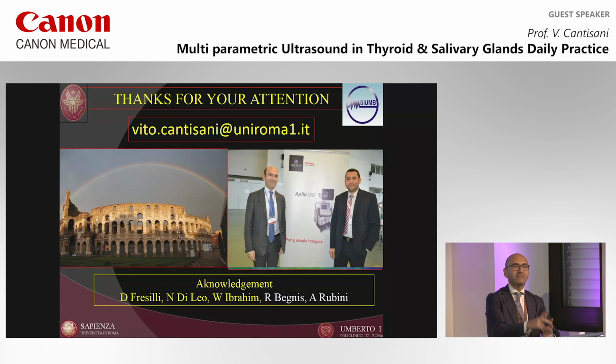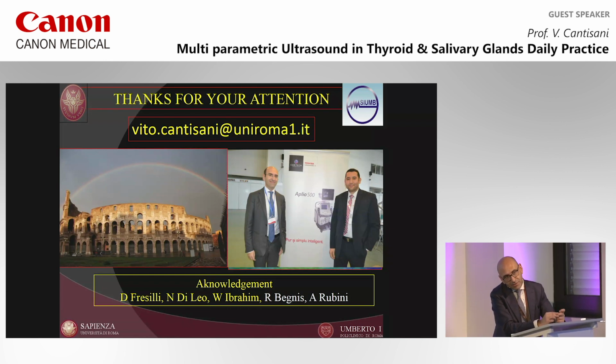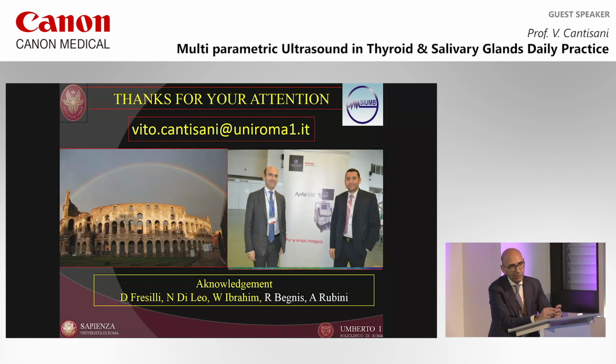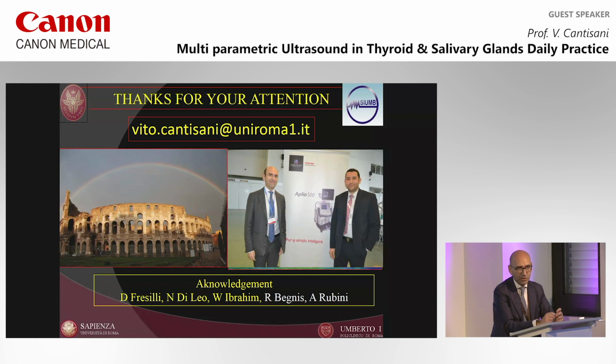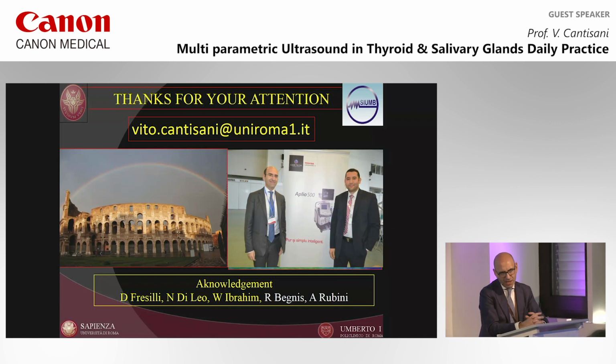Depends, of course. A question for you regarding the vascularity of these neoplasms. If it's highly vascular, how do you differentiate? Because thyroid anyway is a vascular organ. So can we confidently say that the vascularity is abnormal or not? Yeah, that's the reason why we are not including it in our evaluation. So we don't suggest to aspirate a nodule according to the vascularization. But we suggest to use vascularization for salivary glands, because salivary glands are less vascularized, and if something is very vascularized, you can depict it. For thyroid, totally right. In 2010, I published a paper, and I was the first one to come out against the use of color Doppler to predict malignancy. Right now, there are 100 papers confirming that. Yeah, it's just confusing. You know why?